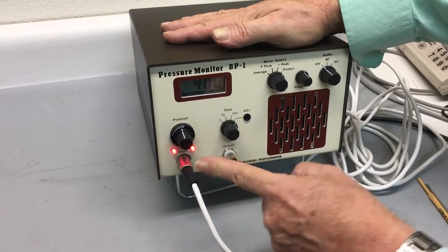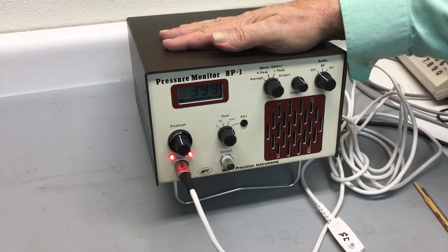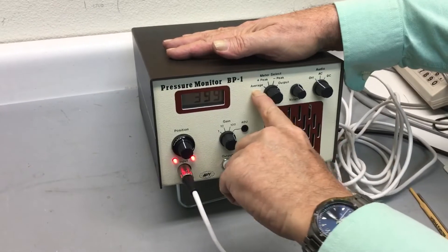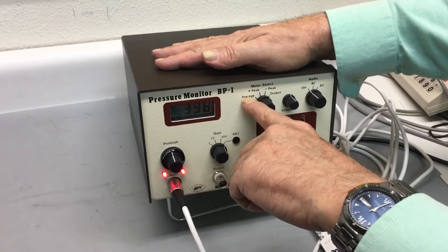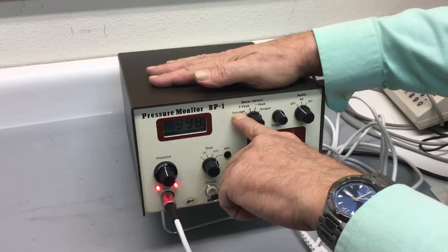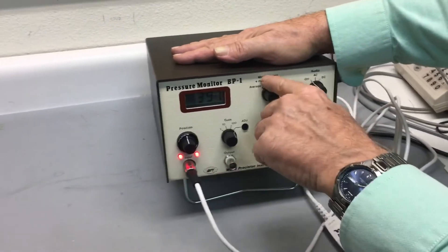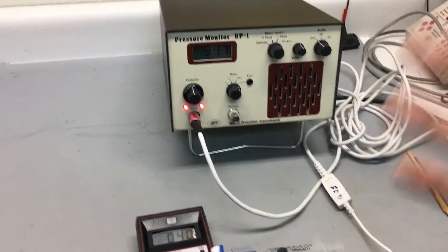You'd be viewing systolic and diastolic pressure using the output connector in output mode connected to the data recorder. The averaging function — people think this is MAP, but it's not MAP; it's just a simple average, invented 40 years ago before MAP was determined. The plus peak and minus peak are supposedly for systolic and diastolic but are not recommended to be used anymore either.